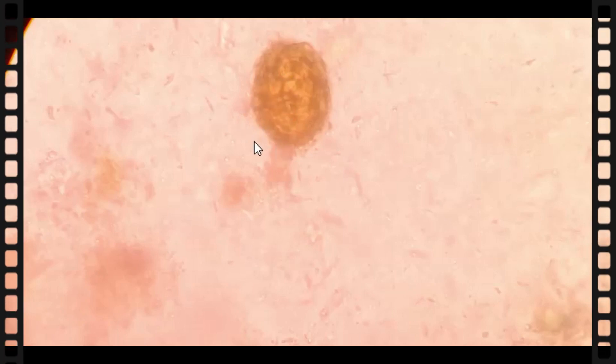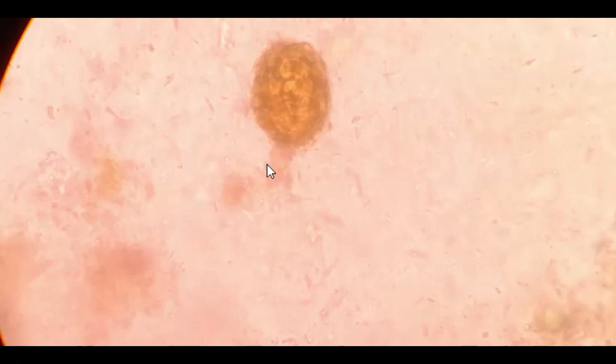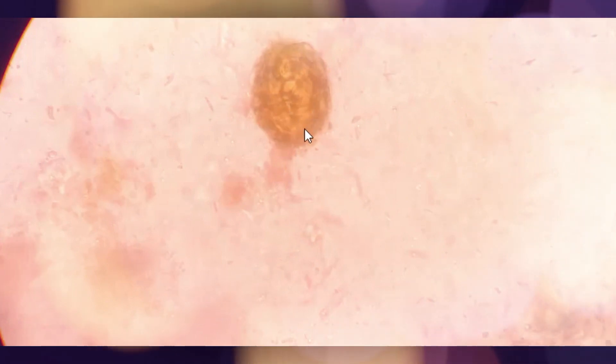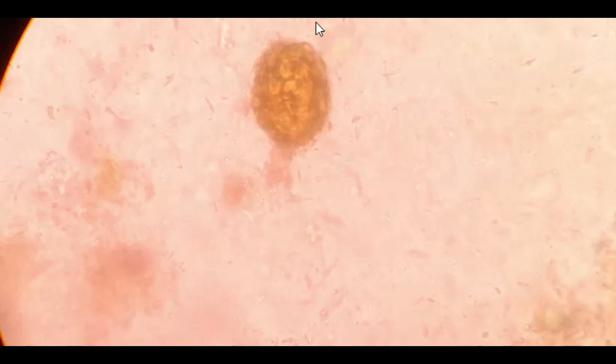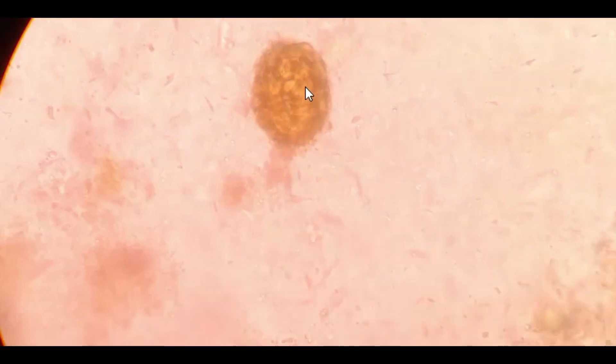Hi! Speak less but do more. The microscope is opened. This is an egg of Ascaris lumbricoides. This egg contains an infective larva, also called the L2 stage, that could infect a person if ingested.